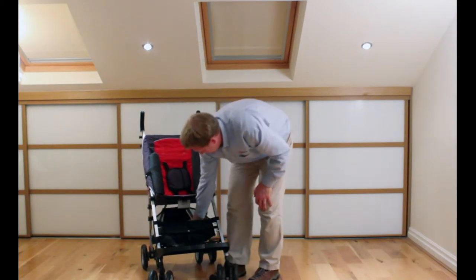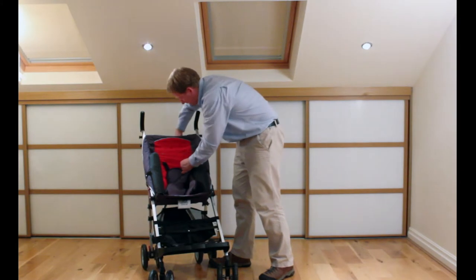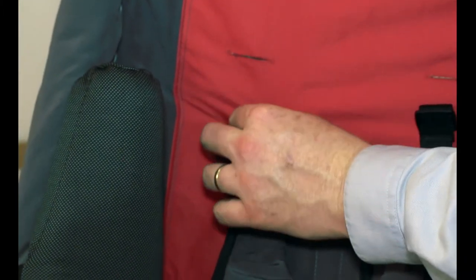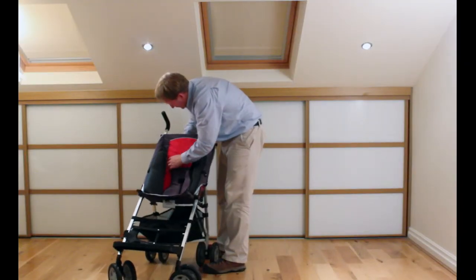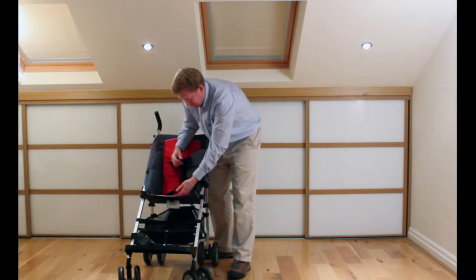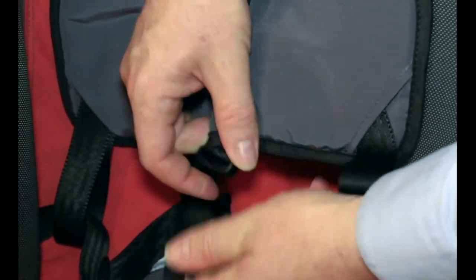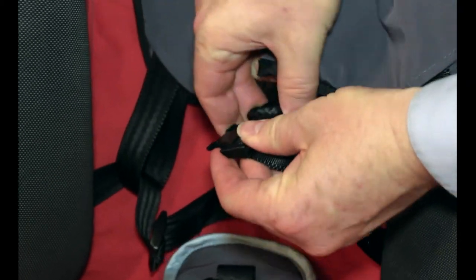If you want something more substantial, then we can use this chest pad. It can go through the same holes or through the upper holes if there's space. You put the top piece through, and then to get the lower section through you've got to unclip the section on the five-point harness — there are some loops at the bottom which you feed the strap back through. Then connect it back up — it just slides together and clicks in place. Do the same with the other side.